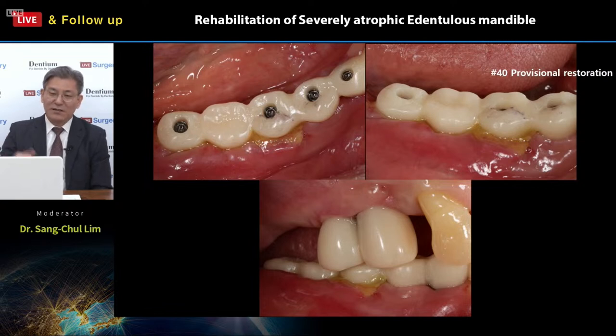However, the healing is faster. Why? How? Because of the collagen graft too. As I mentioned before, this collagen graft promotes soft tissue healing by faster epithelialization of the soft tissues, right? So this collagen graft promotes soft tissue healing, making it faster than any other materials. So we can use these unique properties of materials to make the surgeries better.